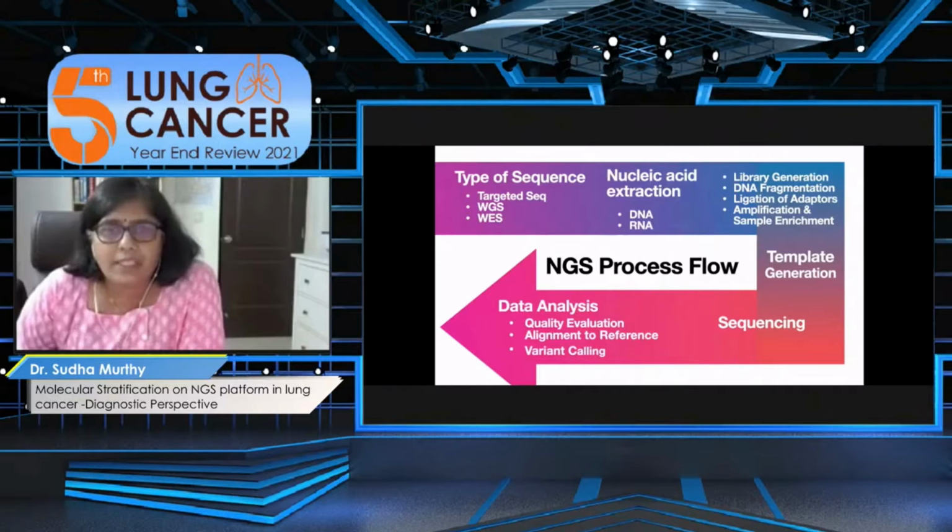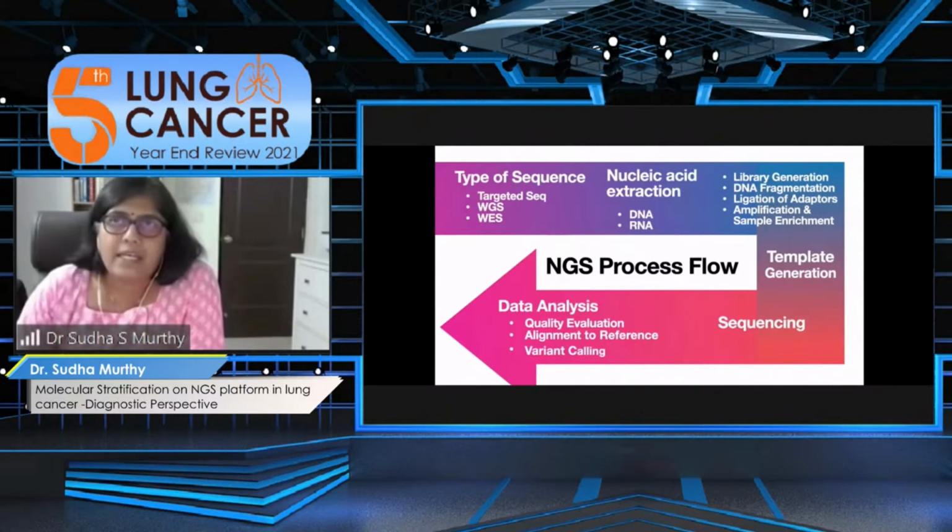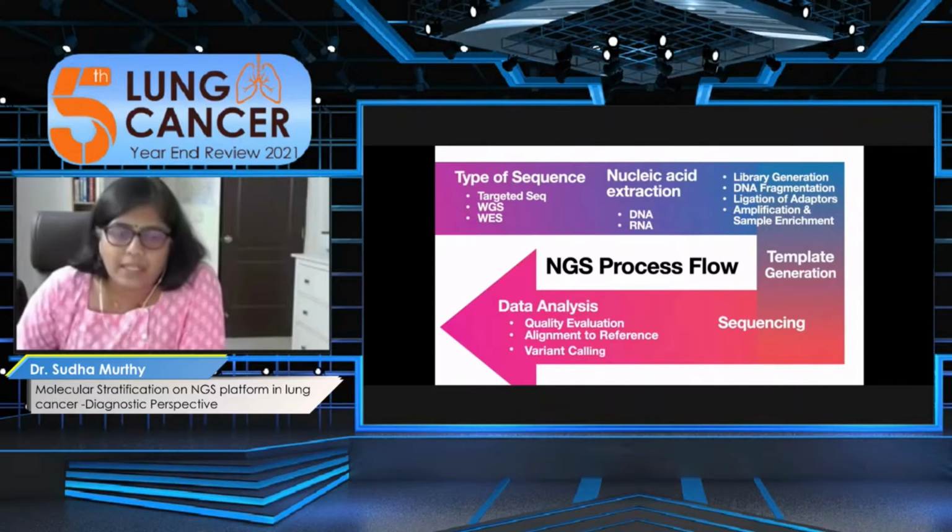So quality is an essential component, and therefore the NCCN guidelines mandate appropriate accreditations. They say CLIA, but it depends on the country. So we have our NABL. So these are the quality measures that have been taken, and these labs need to participate in external quality assurance schemes as well. Data analysis is another important aspect of NGS.